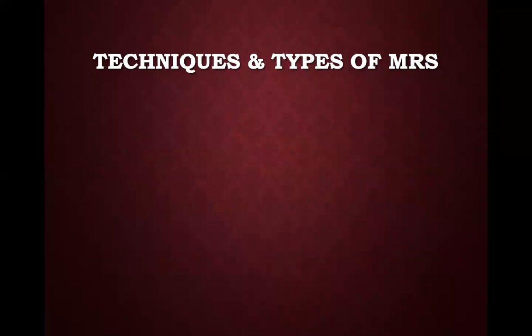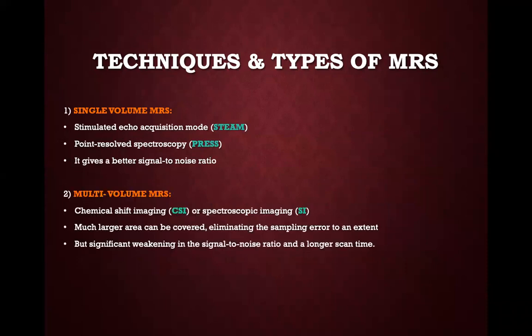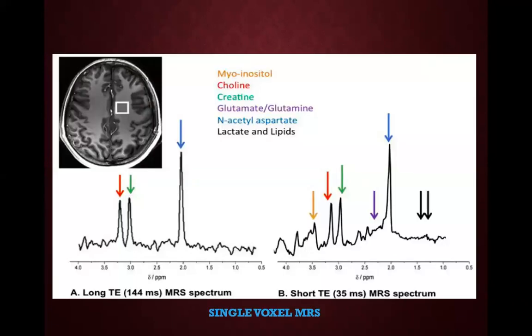That is because each element has a different Larmor signature. Please understand, this is another exam question. There are two types of MRS, single voxel MRS and multi-voxel MRS. Single voxel is where you look at only a slice of tissue. You are looking at just one point. This is like our news media, who focus on only one point, what is needed for them. They don't care about what is happening around them. This is the typical single voxel MRS.